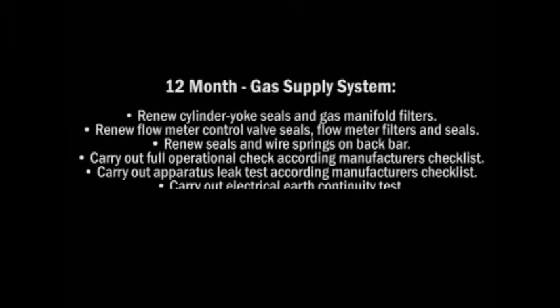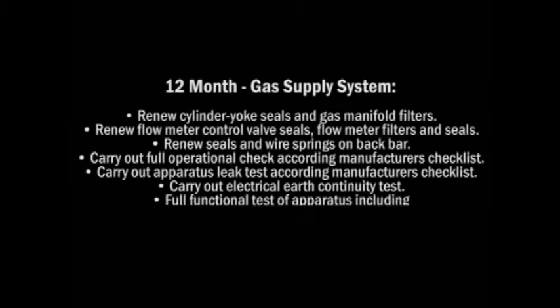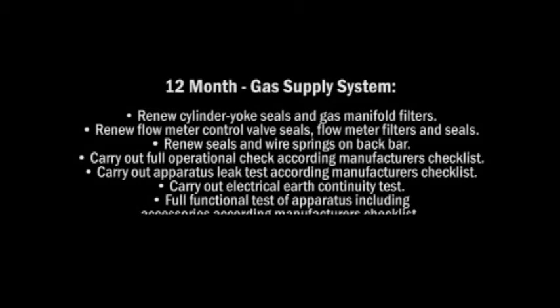Carry out apparatus leak test according to the manufacturer's checklist. Carry out electrical earth continuity test. Full functional test of apparatus including accessories according to the manufacturer's checklist.